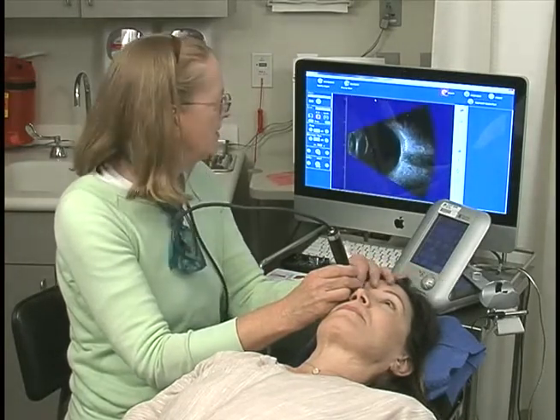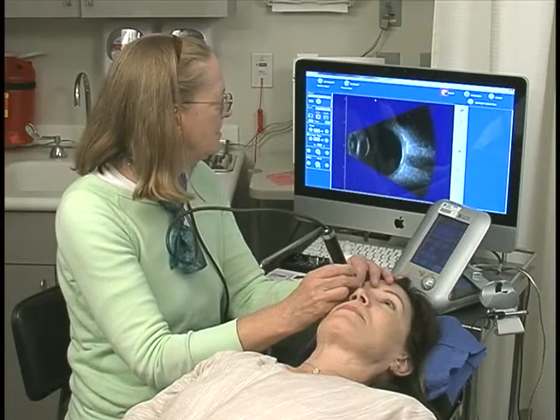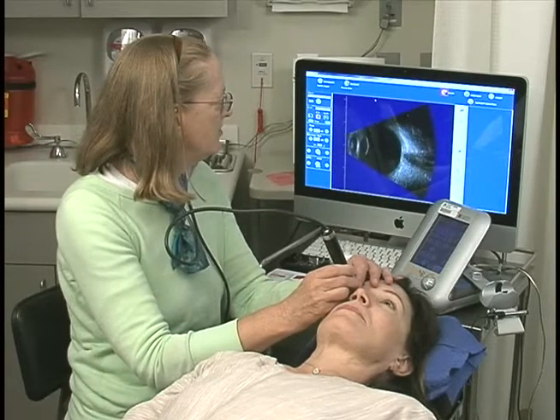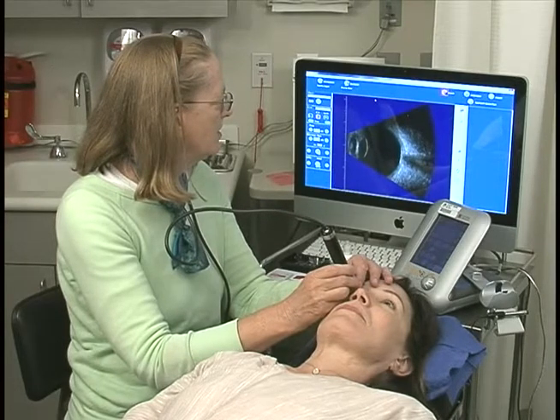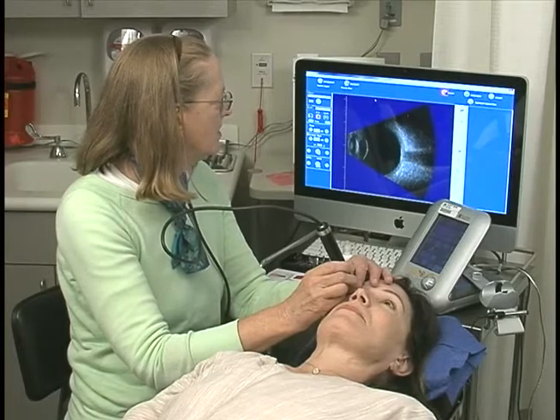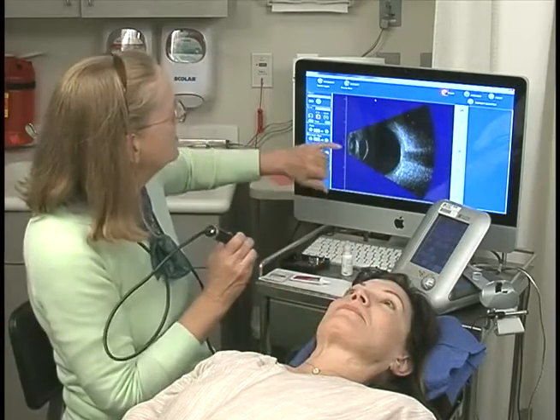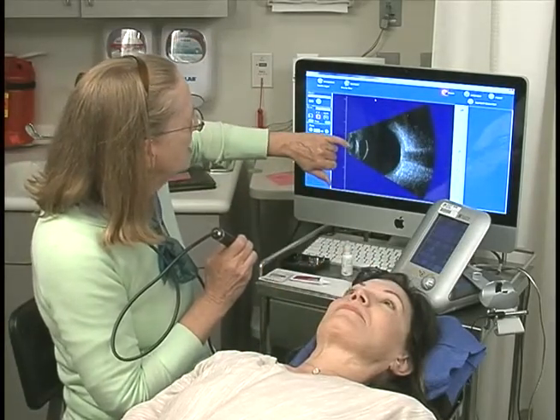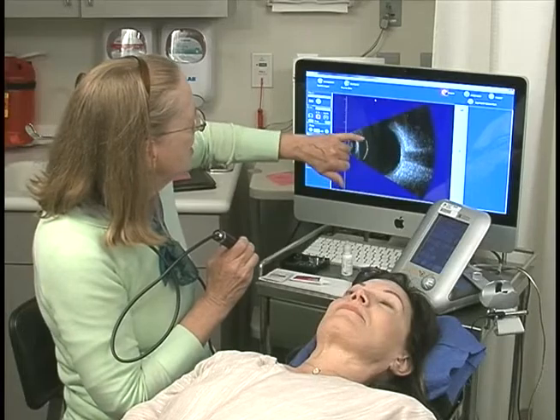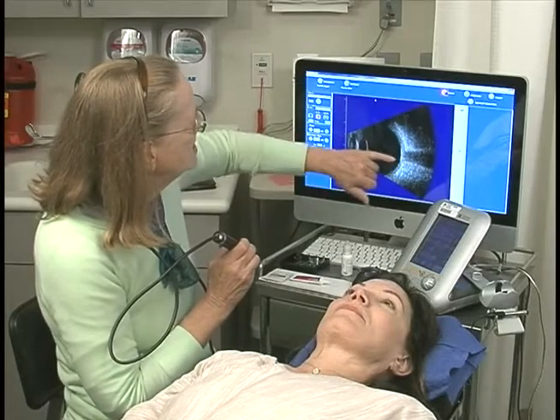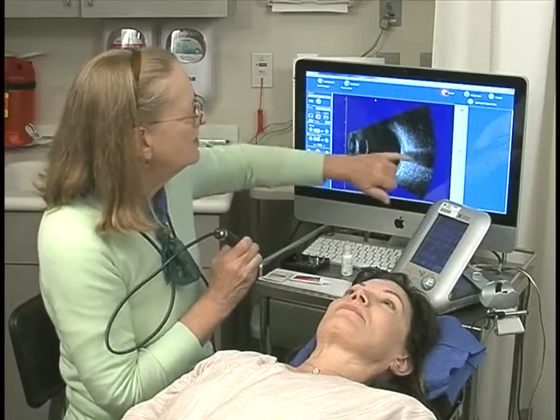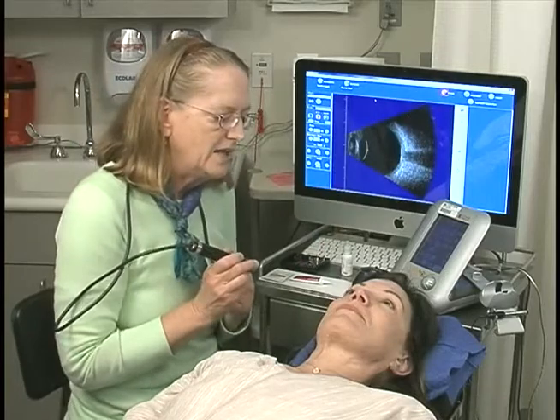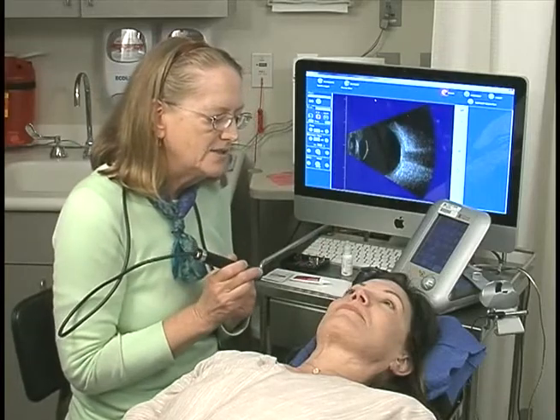Marker superiorly. Lower the gain a little bit — that's a little bit cleaner now. There's the optic nerve, and there's the double peak of the cornea — anterior cornea, posterior cornea, posterior lens capsule, optic nerve. So those are the components of a classic axial scan.